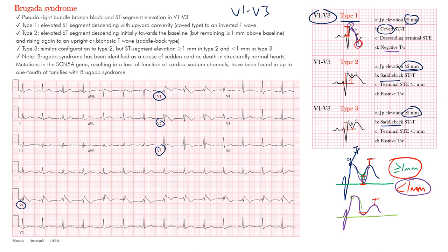Looking at the example EKG — in V1, V2, and V3 — let's focus on V2. Notice the ST segment comes up, then comes down and drops below the baseline into a negative T wave. This is actually a Type 1 pattern. So this is Brugada syndrome, or the Brugada pattern Type 1.